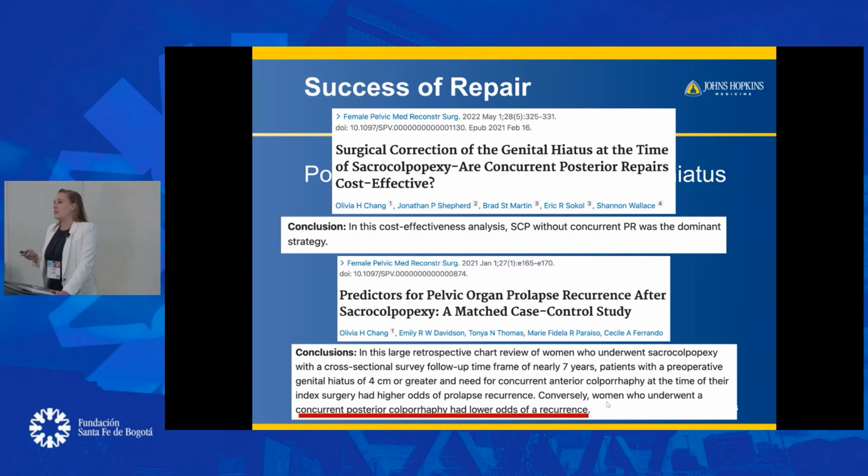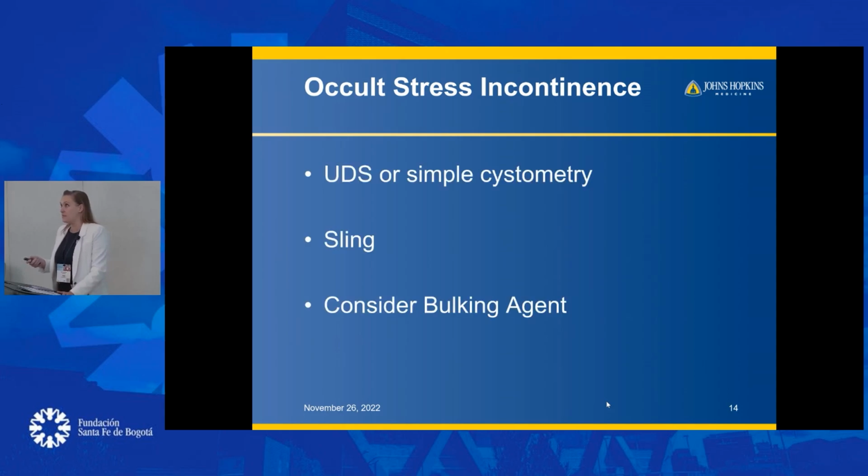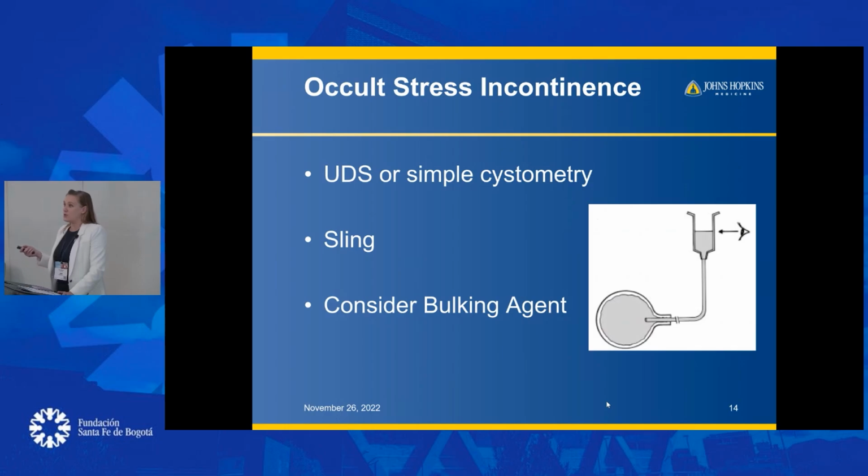Now, another thing that we want to consider is the stress incontinence aspect. So a lot of people get urodynamics, and I just want to let any learners in the group know, make sure you push up that bulge when you do your urodynamics, because that's the way you determine if they're going to have incontinence after that prolapse is pushed up. I do a urodynamics, but in the office, you can actually do a simple cystometry. Dr. Howard Goldman, who is my director of my fellowship, loved this procedure, and it's cheap, it's easy. You can do it right in the office and get a good answer, because if they have occult stress incontinence, I'm going to put a sling in.